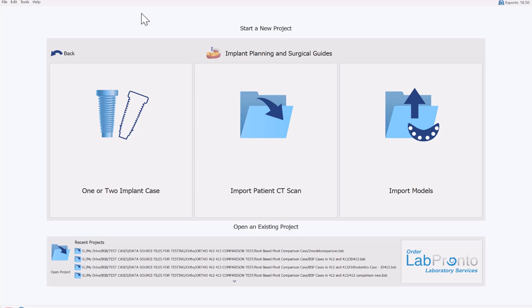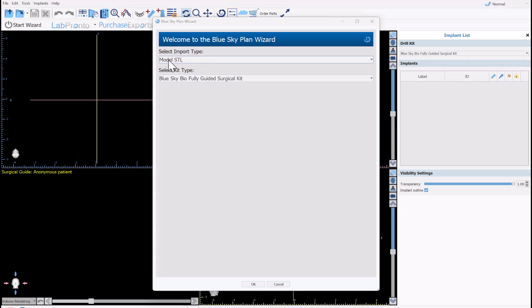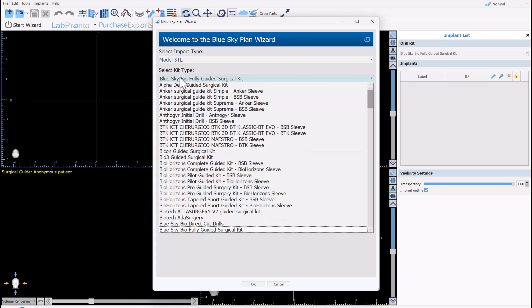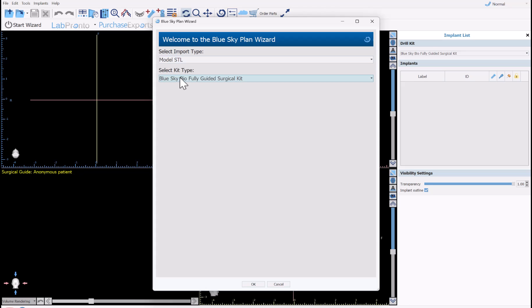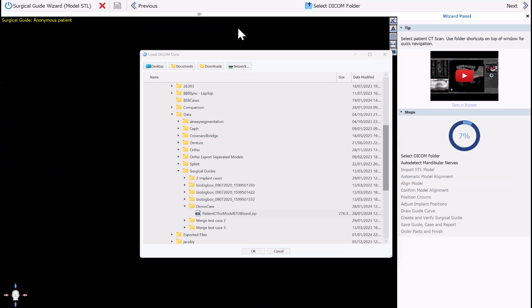I'll provide a link to the data set I'm going to be using so you can follow along on your computer step by step. I'm going to click the option for one or two implant case, which is our wizard process flow that takes us step by step through placing the implant and creating the surgical guide. We'll confirm our selection of model STL as the preferred import type and select the relevant surgical guide kit. We recommend the Blue Sky Bio fully guided surgical kit, but there are more than 70 different implant systems in the software. Select the relevant kit and click OK.